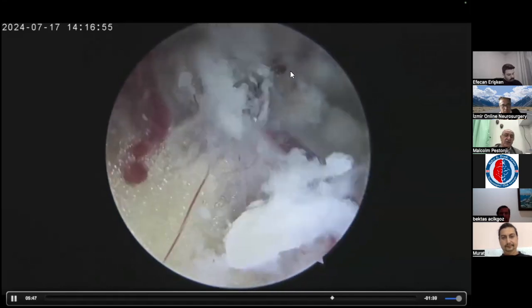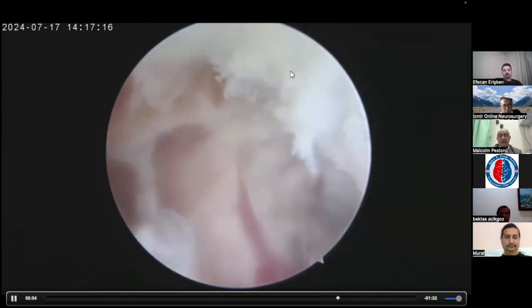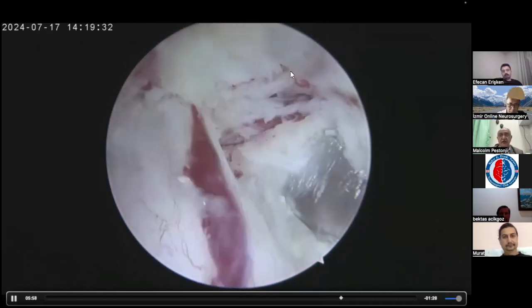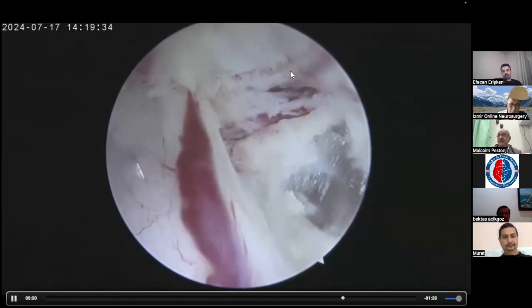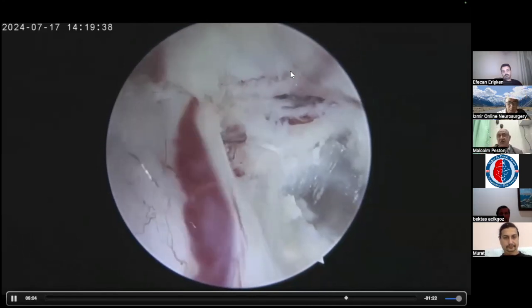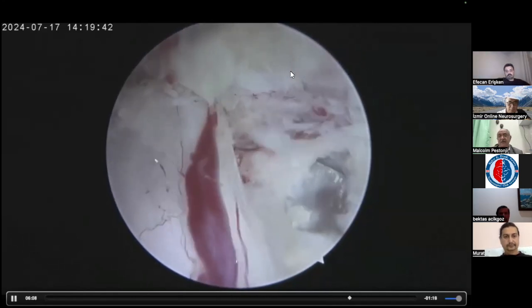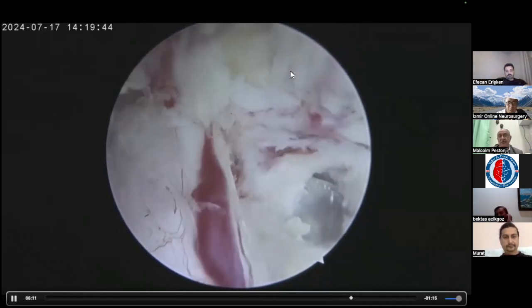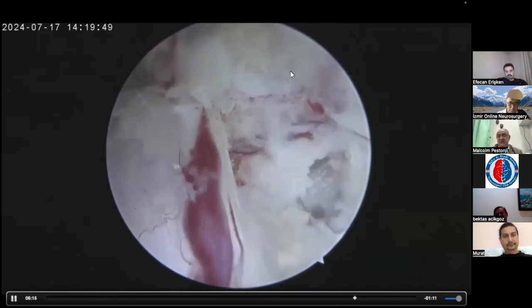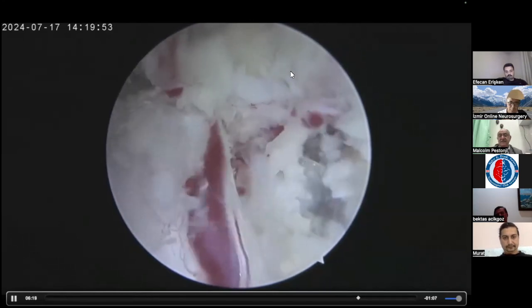So first I broke from underneath the axilla and underneath the central cord. Now I've broken down from outside, removing some more, clearing up all the tissues. Now I'm using a spatula to break the rest of this claw from below the root. Can you see that? It's banging into that piece of bone, which has elevated and locked the root. So I have to break this completely. See how it breaks.